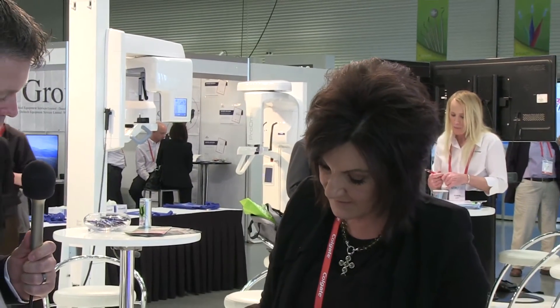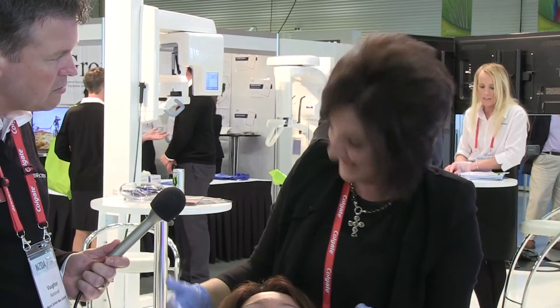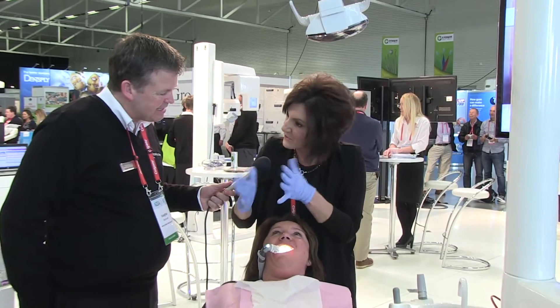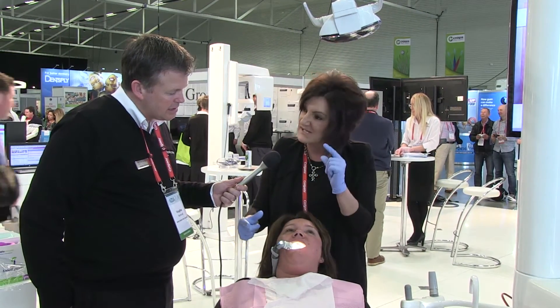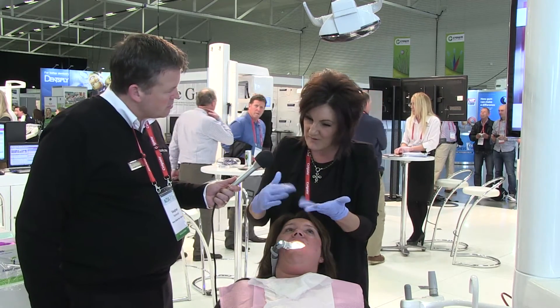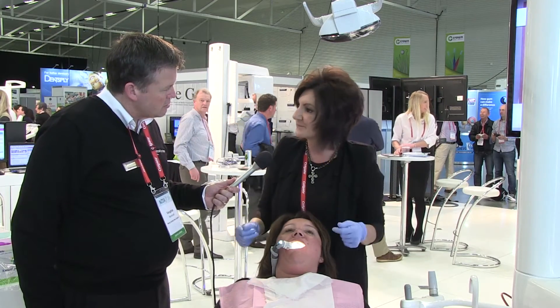What's the suction quality like? We have multiple lines — dual evacuation. These little levers control the evacuation, and you can have upper or lower. For patients with root sensitivity, you can control the evacuation so they're not getting cold or chilled, which is quite comfortable for them. Because of the plastic polymer, the patient can sort of chew on it a little bit — as opposed to biting on a hard rubber bite block, it's almost like a passive chew.